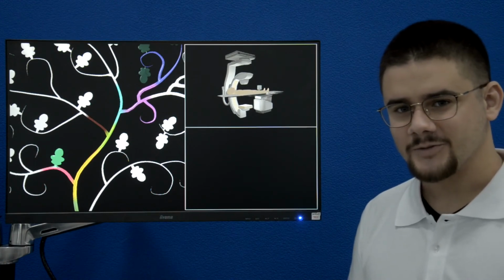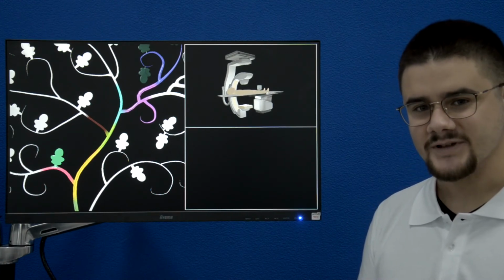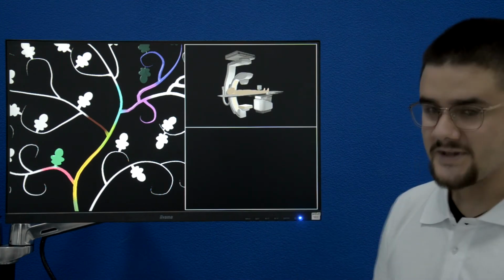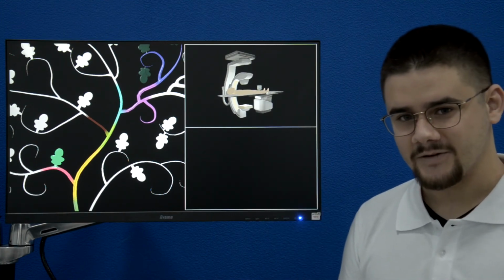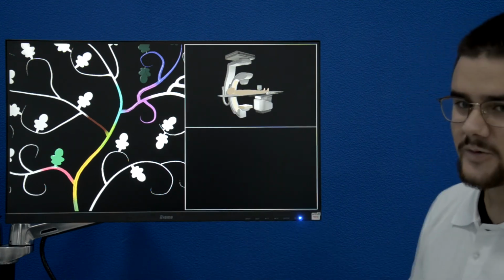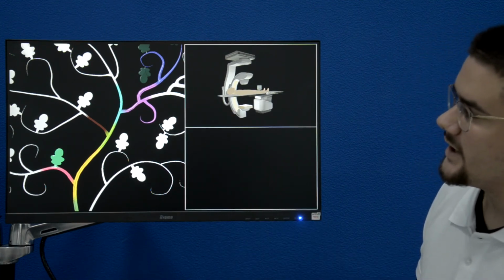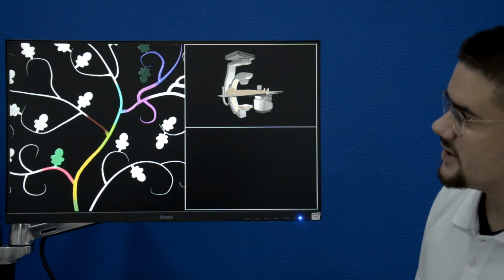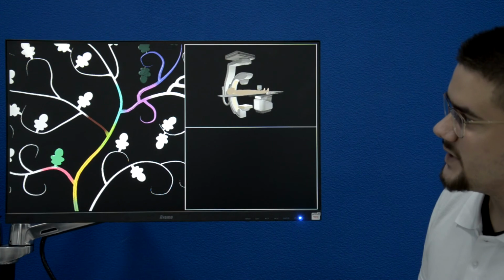A fact that we would like to bring to your attention is also the realistic and smooth behavior of our imitated catheter in software. I want to illustrate it with this abstract environment module where you can see, when I am introducing the guide wire, it going in loops, and the behavior of it is very realistic.